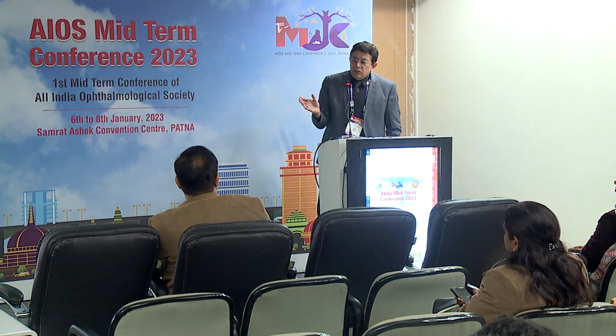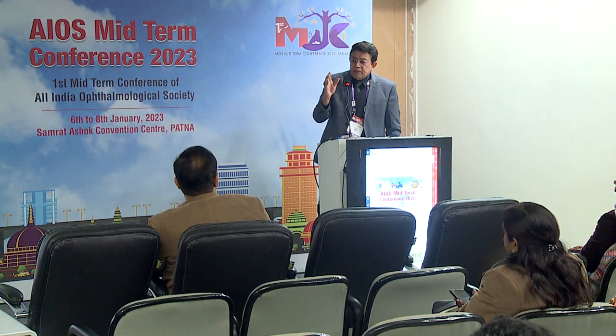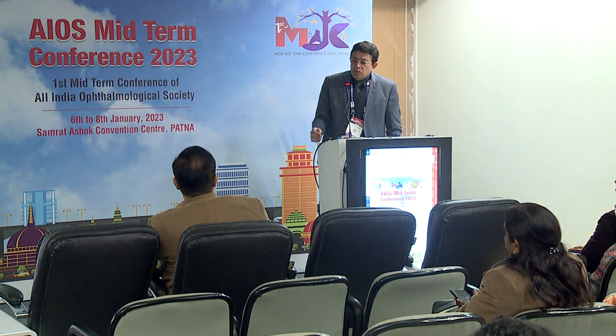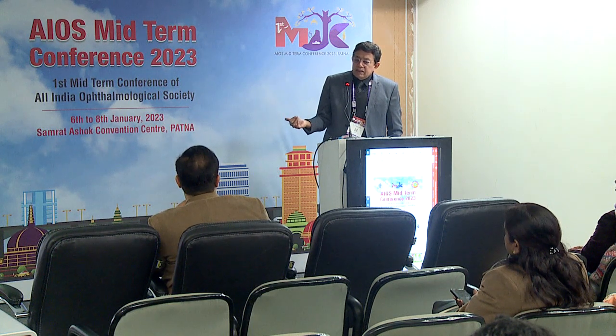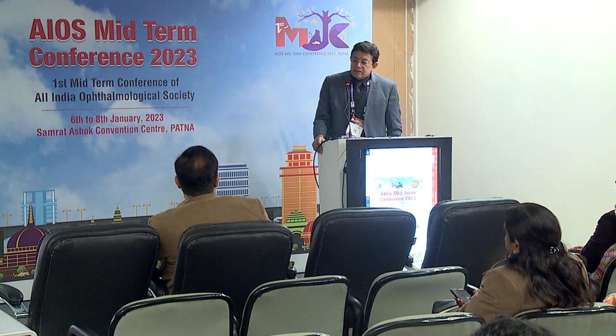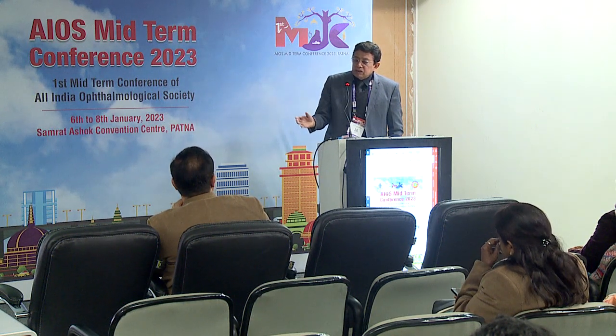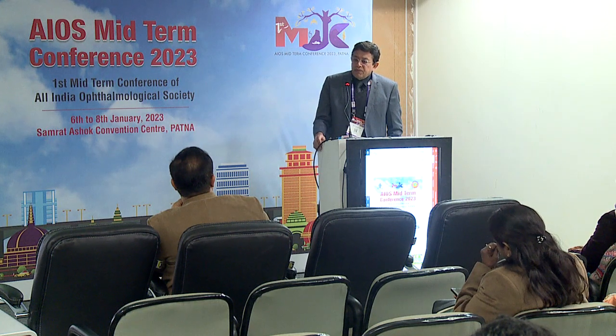But if it's against the rule astigmatism in a pediatric cataract, because the posterior corneal astigmatism as well as the change that is going to occur in the lifetime of the patient is going to potentiate this, it's important that you use a toric intraocular lens in these cases. So I did mention differentiating between with the rule and against the rule. That becomes all the more important in pediatric cases. Undercorrect grossly the with the rule astigmatism, or stay away from correcting with the rule astigmatism. Against the rule astigmatism, if it's there, even for 0.5 or 0.7 diopters, I'll go ahead and correct it.